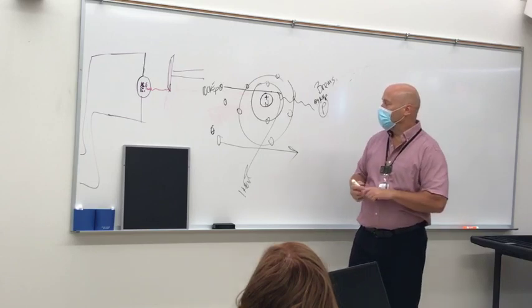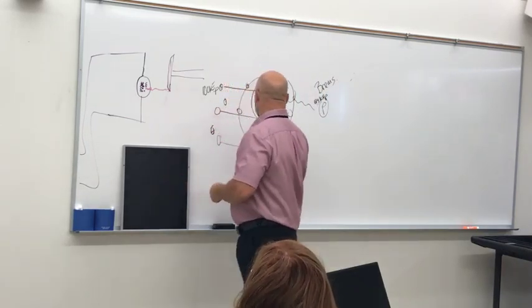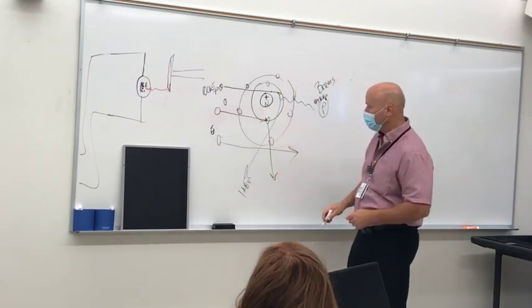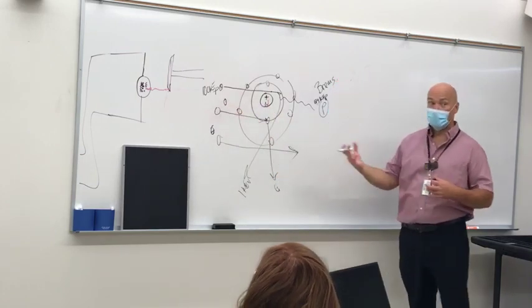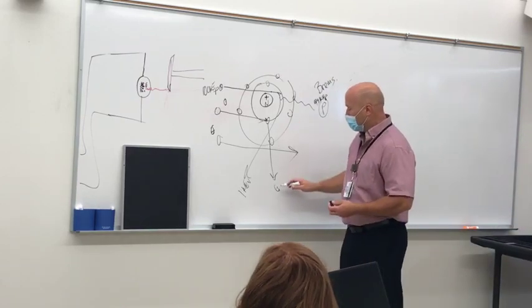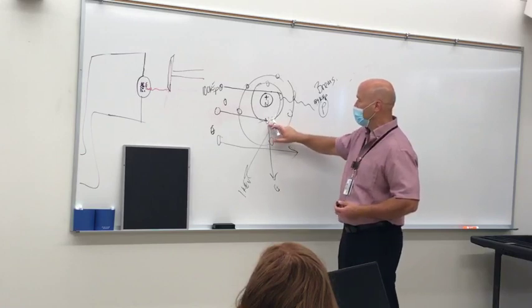The other way is if the electron comes in and strikes one of these orbital electrons and pops it out of place. So now you've got a free radical. In the X-ray tube it doesn't really matter, but the same thing happens inside of your body. So we eject this electron, and now we've got a vacancy here.